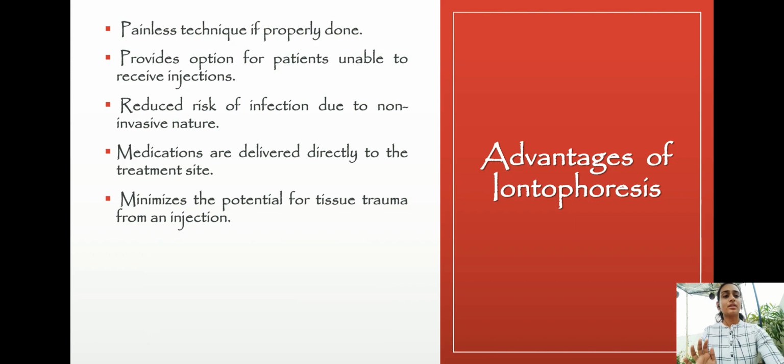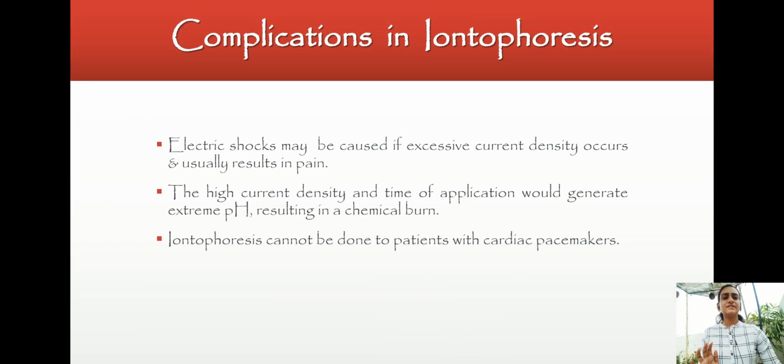Now let us see a few complications, and let's come up with some solutions and how we deal with them. Electric shocks may be caused if excessive current density occurs and usually result in pain. The shocks here don't mean the major shocks which paralyze or result in death. The shocks here mean the short, minor shocks which just result in pain.